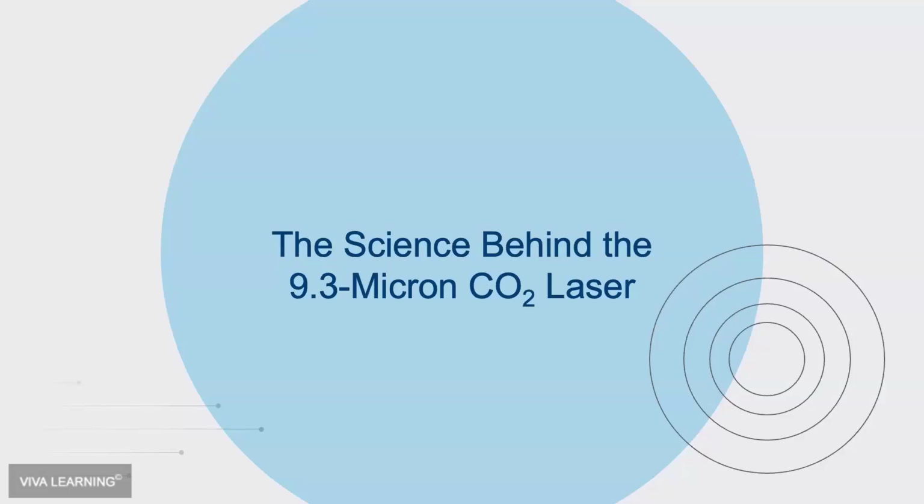Well, one way we look at the way lasers cut, I wish it was more like a lightsaber, but in some ways it's more simple than that, and that is absorption. If I put a steak under a restaurant heating lamp, that steak is going to be warm because it's absorbing that infrared energy, the infrared wavelength from the heating lamp. If I want to cut any tissue or sheet metal or concrete, I need to make sure that substance is actually absorbing that energy to the point of ablating it.